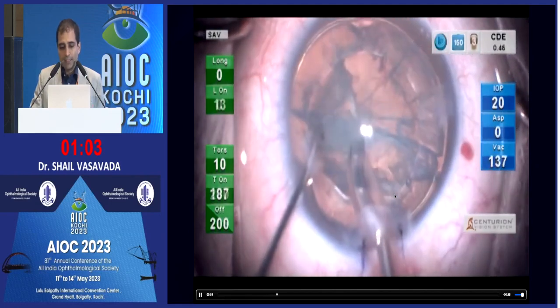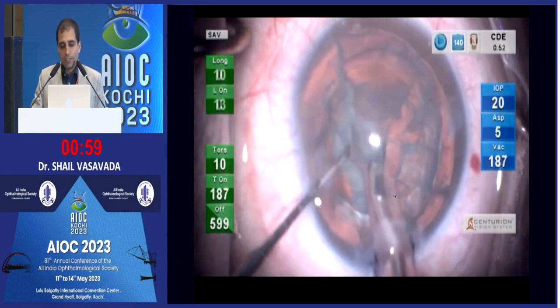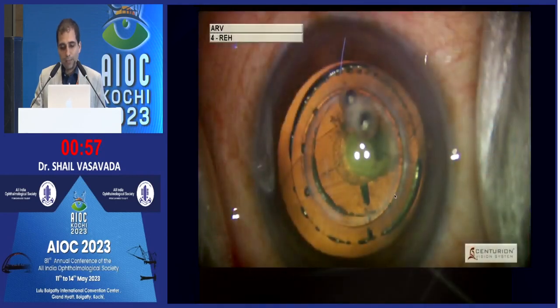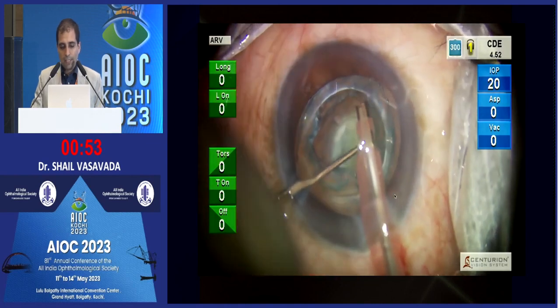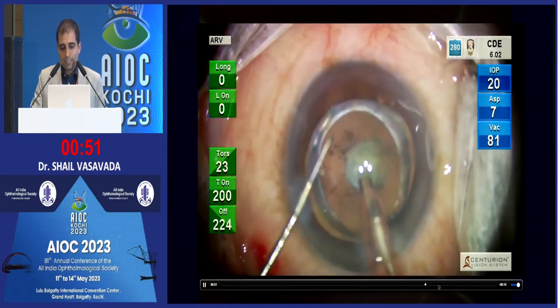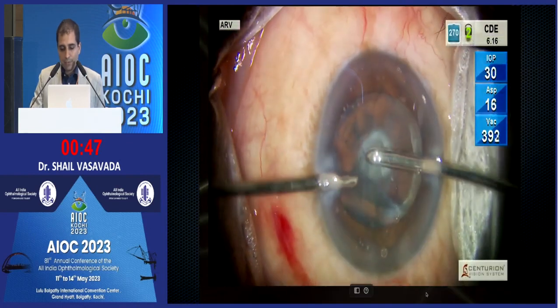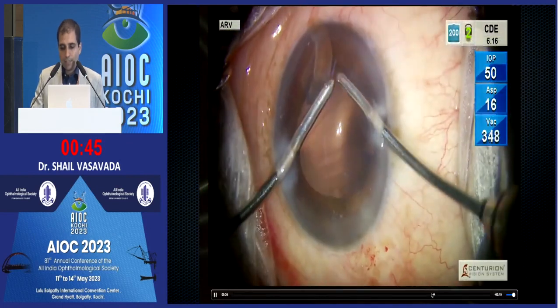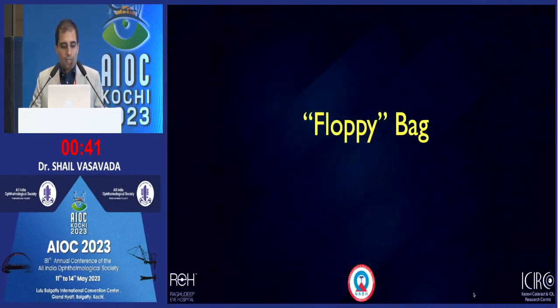And these eyes typically are extremely high myopes, so a very low intraocular pressure generally suffices, like 20 millimeters. And you can follow these principles even in cases of posterior polar with pre-existing defect, protecting the polar until the very end, so that the chamber doesn't fluctuate and there is no split in the capsule.